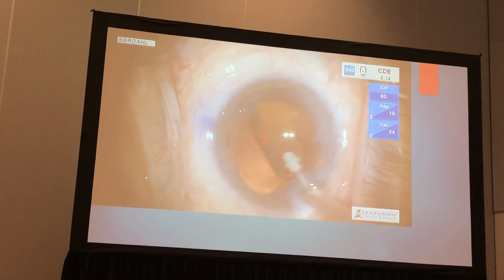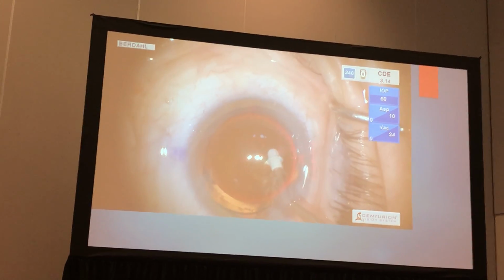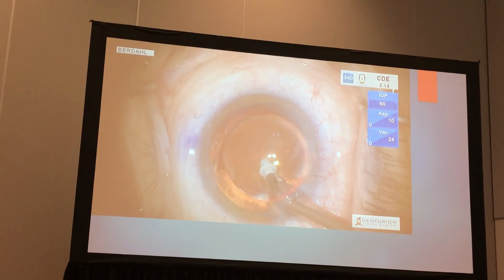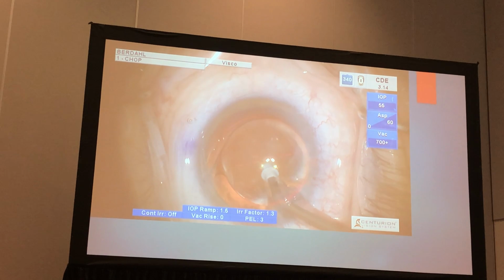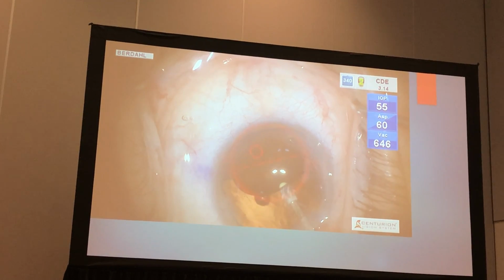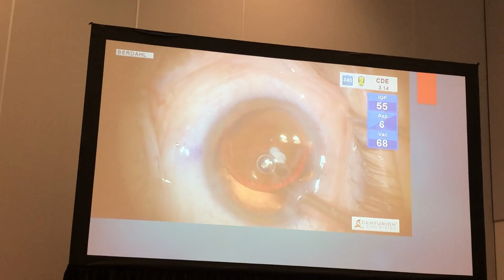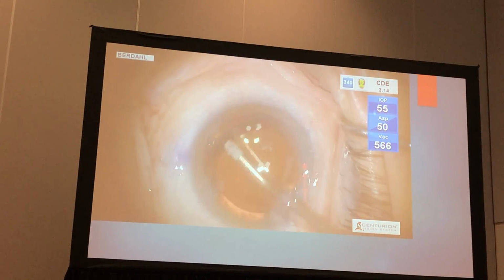So now, if the numbers match up well, which they do in this case, I just make sure I get my toric lens lined up exactly where I want it to be, and the reticle is exactly where I want it to be. I love that alignment. So then I get the viscoelastic out from behind the lens. You know, one of the things in particular that I like about the Acrysof platform is its rotational stability. That's really important. So I like to make sure I get all the viscoelastic out from behind the lens.